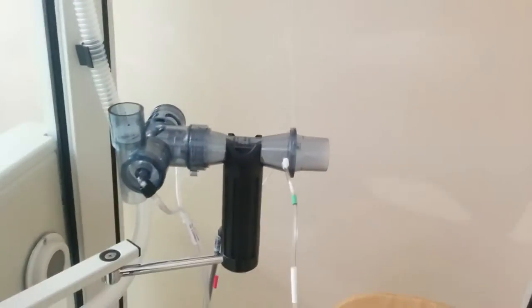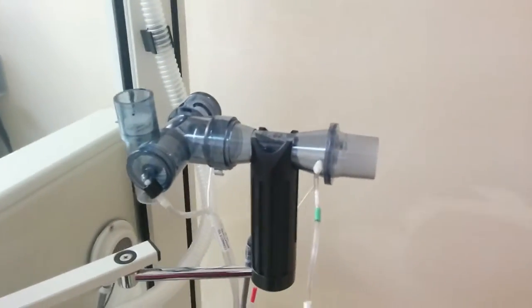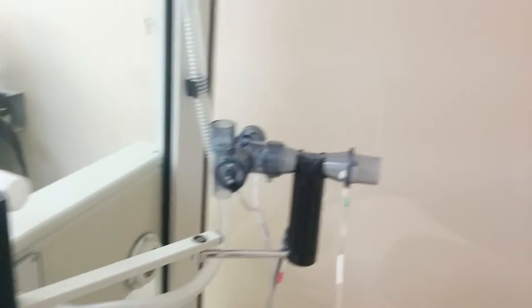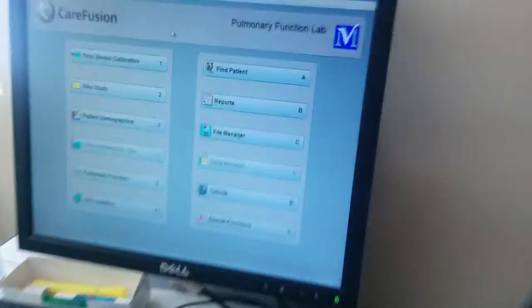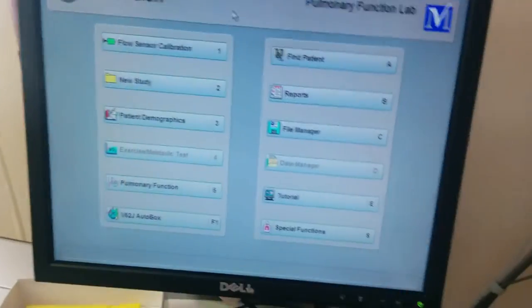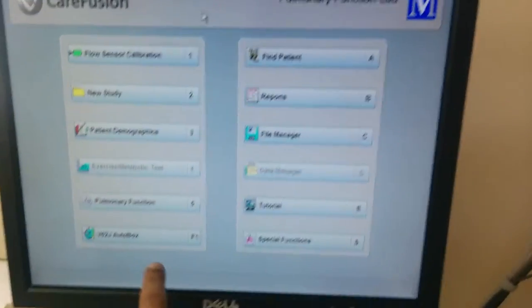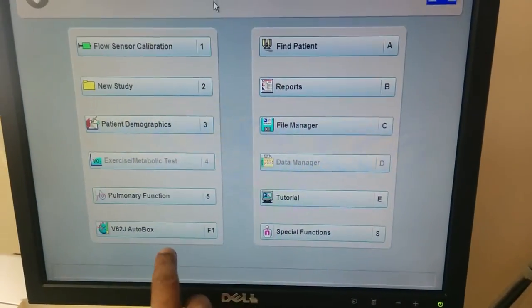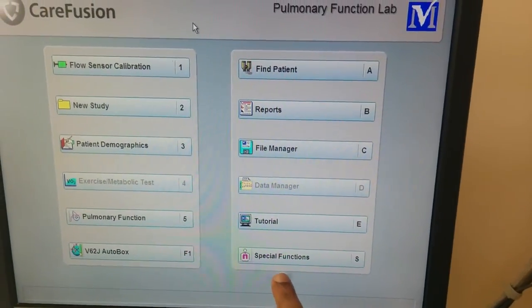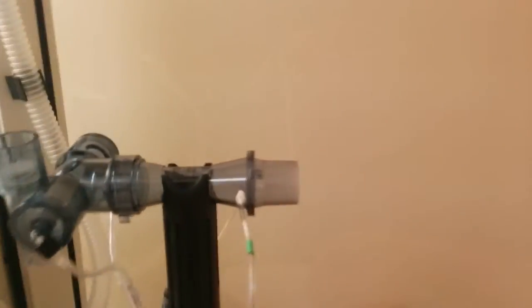When something goes wrong with the flow sensor, first of all, there will be an indication or a message at the bottom saying that the flow sensor is not working. You need to either recalibrate the flow sensor or change the flow sensor. Once you see that, you have to come.